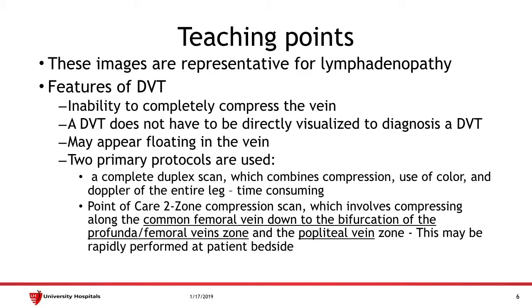To review the features of a DVT: in the presence of a DVT, you would be unable to completely compress the vein. A DVT does not have to be directly visualized to diagnose a DVT — the inability to compress the vein is enough to make the diagnosis. However, directly visualizing the DVT is helpful. A DVT may appear floating within the vein and does not have to be completely occluding or attached to the vein walls.